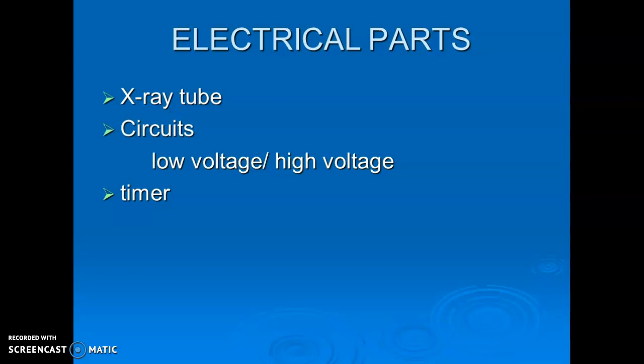And then also your timer has a separate electrical control. It is an electrical timer. They used to be manual timers, but as the film has gotten faster, and then we've converted even over to digital, which is even faster exposures, the timer has to be so specific and such small increments of time that they did have to go to an electrical or digital timer.